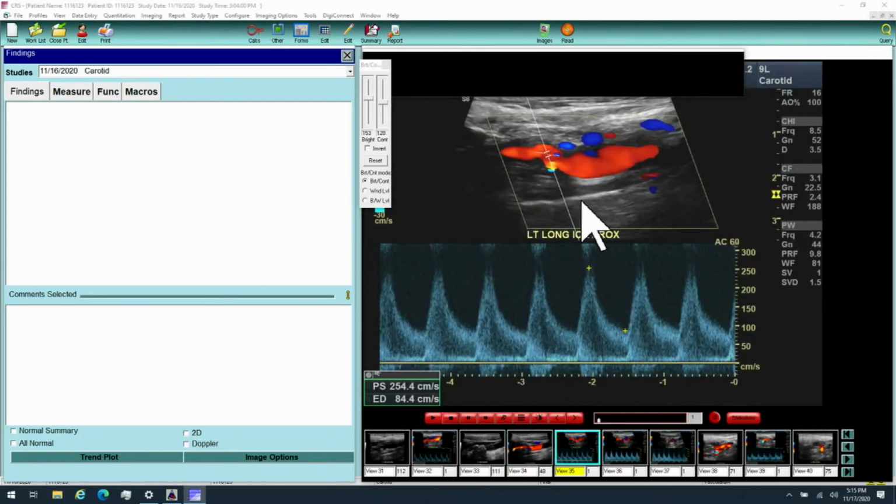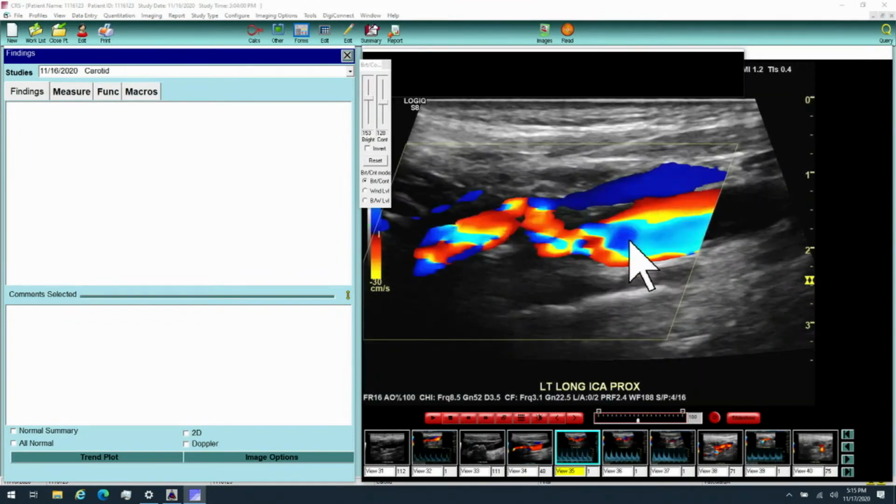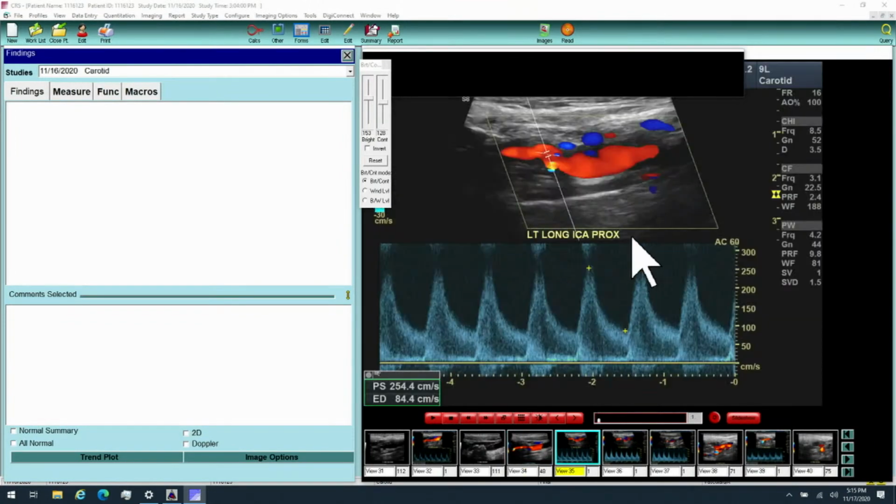This is so funny. This is your own scan and you're still critiquing it. Oh my God, it's true. I can make you go back to the ECA. No, never.